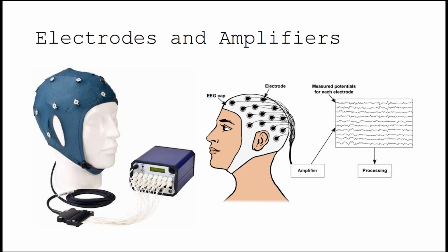However, there are several limits. As you can see, the amplitude of the scalp activity, the power that is generated by your brain, is quite small. So those amplifiers really need to literally amplify those signals so that they will be visible on the screen. On the right side, you can now see a schematic view of this.